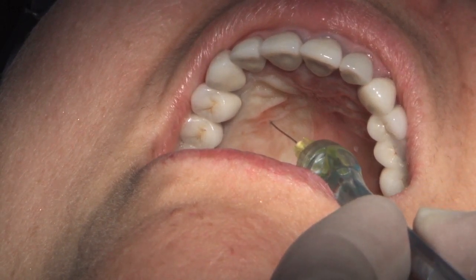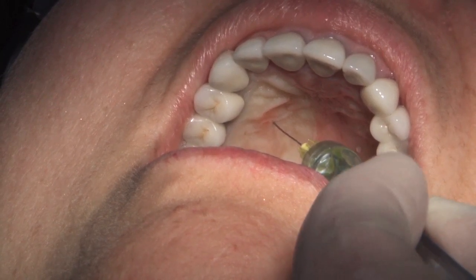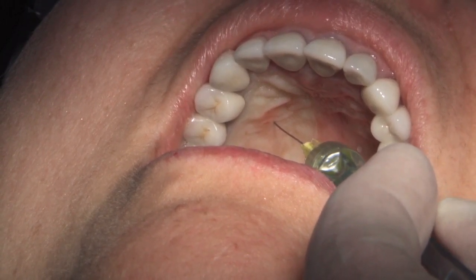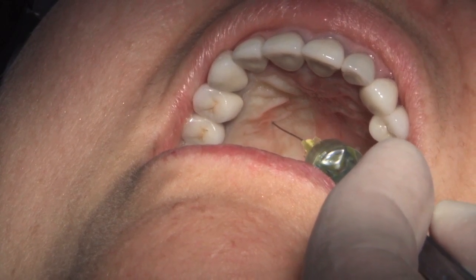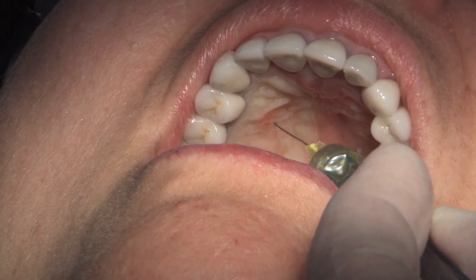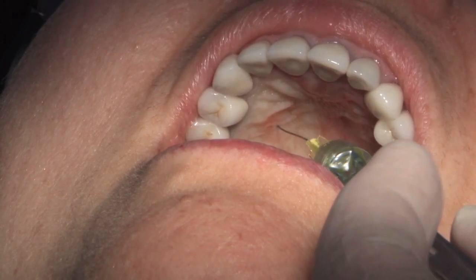Depending on what drug we're using, we're going to use anywhere from a half cartridge to a full cartridge, and you base it less on how much has gone from the cartridge versus the blanching pattern. The blanching pattern basically tells you when you're done. Anytime you start seeing it actually dripping back out of the penetration site, you know the tissue's just not accommodating any more solution.